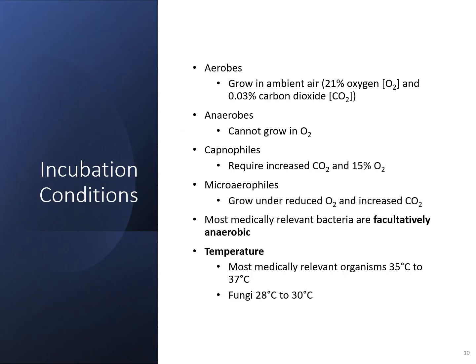So depending on which organism or pathogen you're looking for in a particular sample will depend on where you actually incubate those agar plates. If you're looking for an aerobic type organism, these are incubated in ambient air, and so this would go directly into the incubator with an oxygen of about 21% with a very low CO2. Your anaerobes cannot grow in the presence of O2, so those would go into some sort of anaerobic bag to prevent any sort of exposure to O2.